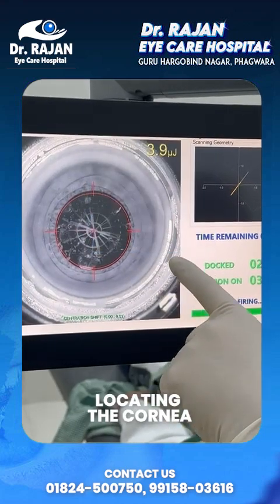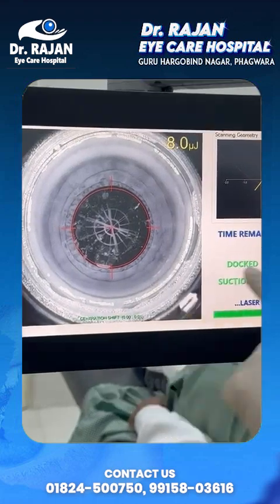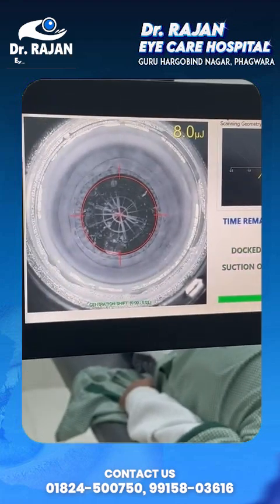We are locating the cornea and now we are giving the incision on the cornea — this is the corneal incision. One second remaining and the surgery is done. This is called robotic cataract surgery.